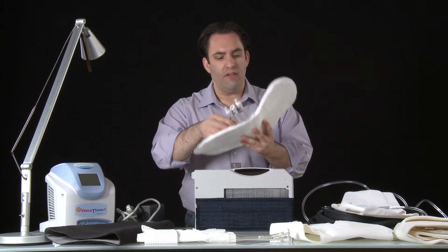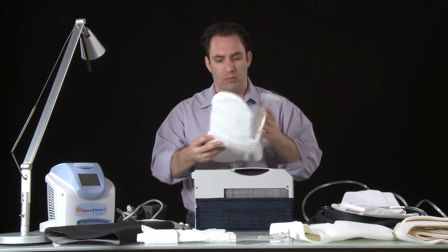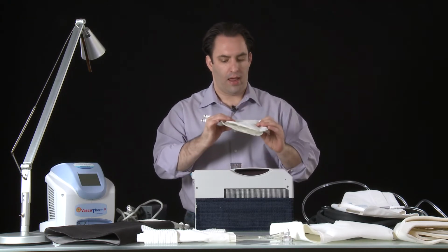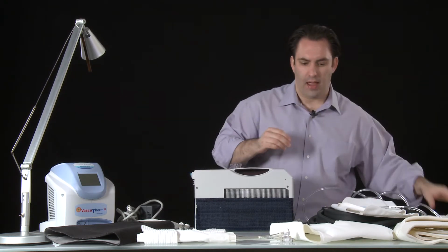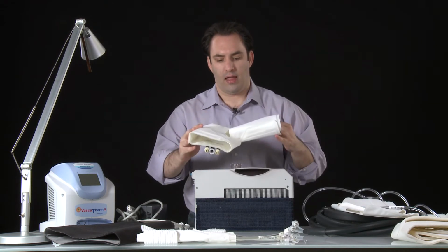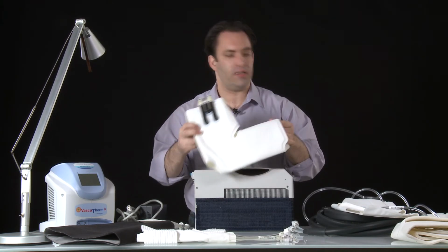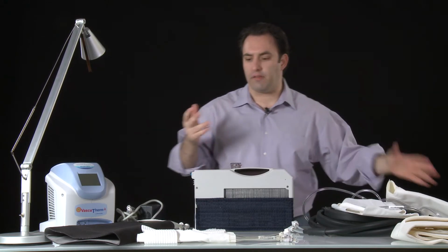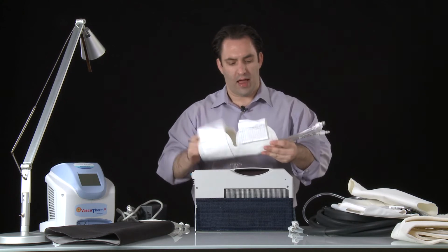Now, if I have gotten my disposable from the hospital, I may have something that looks like this. This is a double butterfly. That could be over my knee. I may have a wrap that's like this. This could be over my elbow or my foot. I could have a larger butterfly, a smaller butterfly. This is a smaller butterfly. And you get the idea.